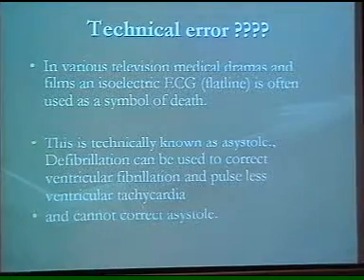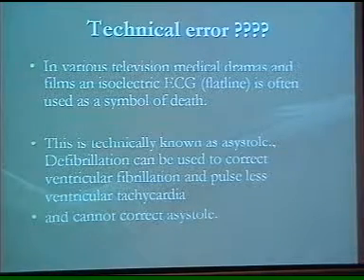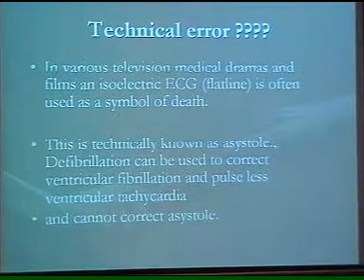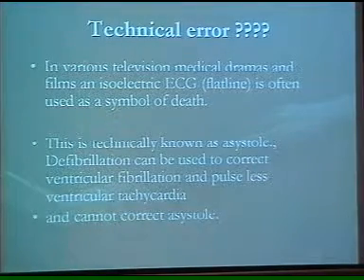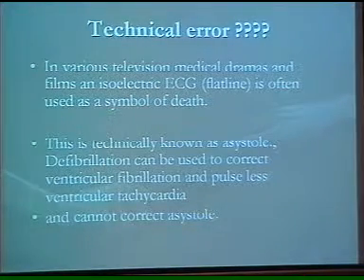I will end my presentation with a technical error which we all see in television and movies. Everybody has seen a flat line in ECG in movies where they show that the victim has died, or the hero has died, the villain has died. So they show a flat line as a symbol of death.